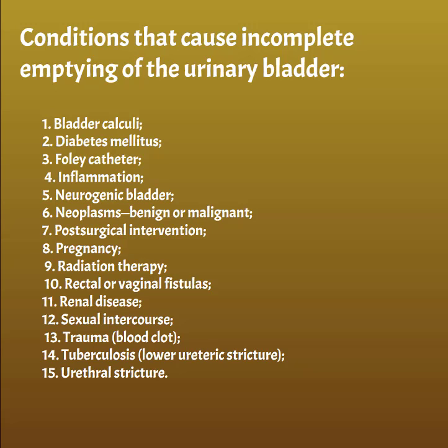So tons of reasons why a patient may not be able to empty. And our job is to see if we can find any of these. Most of these we can have some role with in helping to find, especially looking for blood clots, supplementing with pictures of the kidneys to figure out renal disease, pregnancy, neoplasms, inflammation, Foley catheter. All of those are things that we can kind of look for with ultrasound.